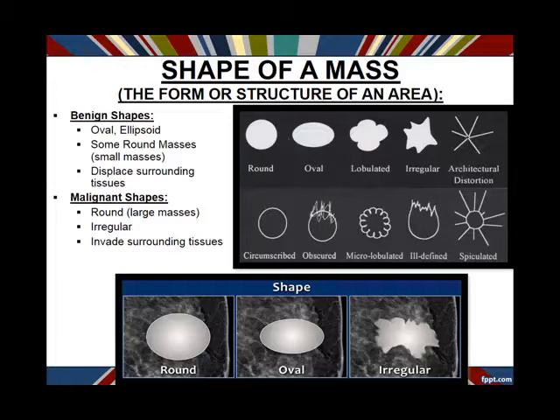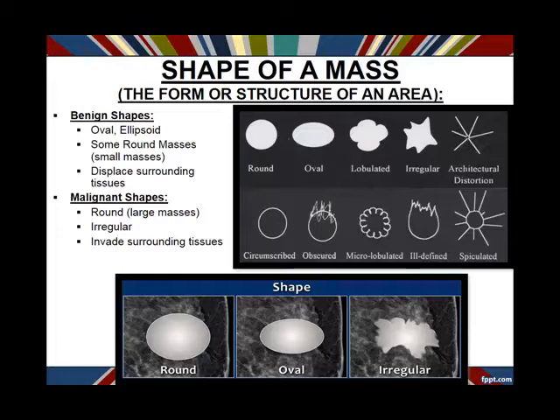Our oval category is always going to be benign because of that AP dimension. When we get to round masses, the AP dimension starts getting bigger — round masses are equal on all sides. So a round mass is in our intermediate category: it can be benign or malignant. We start worrying about round masses because their AP dimension starts equaling the other dimensions, meaning it's in danger of becoming even more vertical. Round masses, depending on other characteristics, get more attention because we start thinking about whether the AP dimension might grow. However, something like a cyst can be round and totally fine since a cyst doesn't have potential to grow taller or vertical.